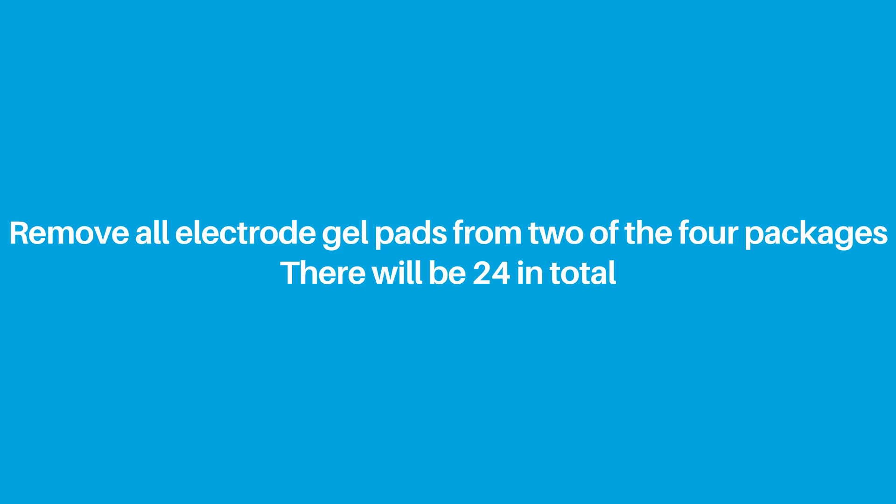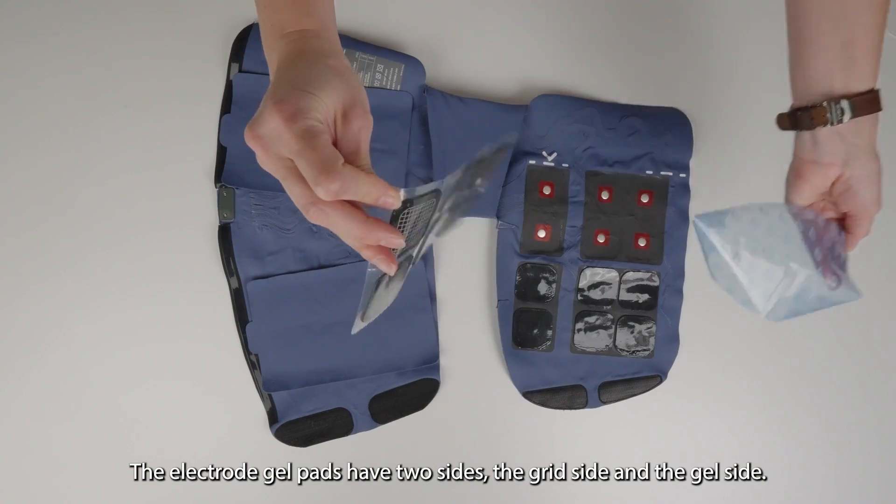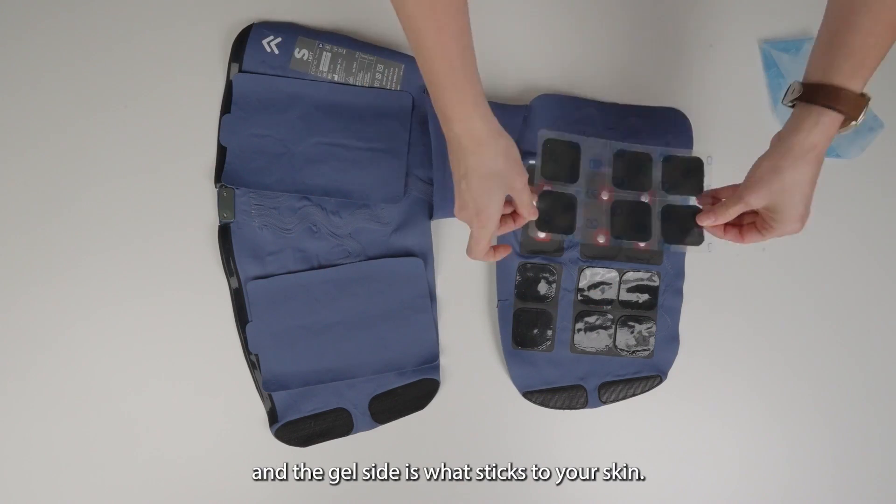Remove all electrode gel pads from two of the four packages. There will be 24 in total. The electrode gel pads have two sides: the grid side and the gel side. The grid side is the side that adheres to the Neural Sleeve. The gel side is what sticks to your skin.